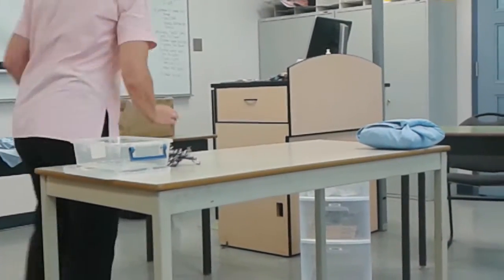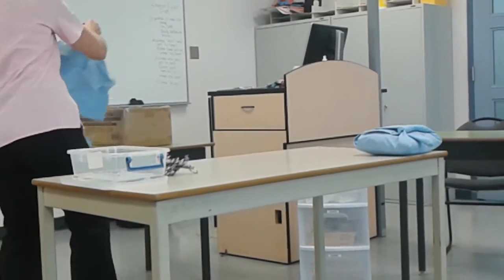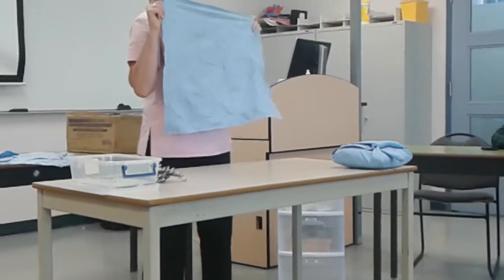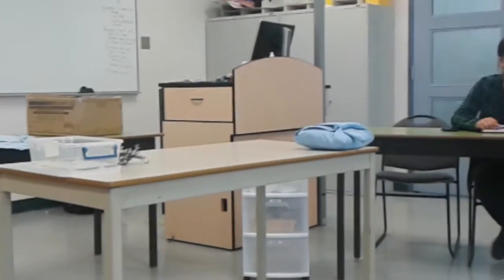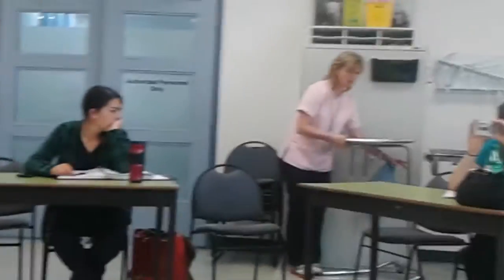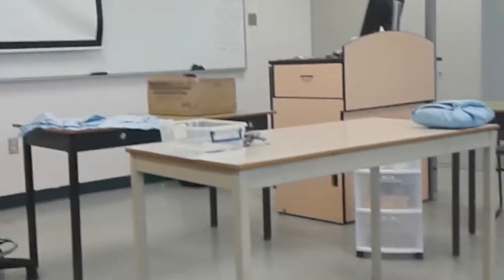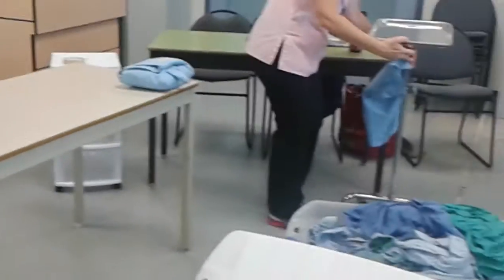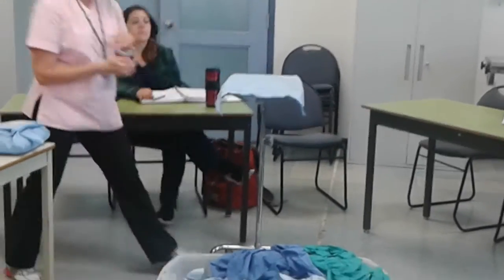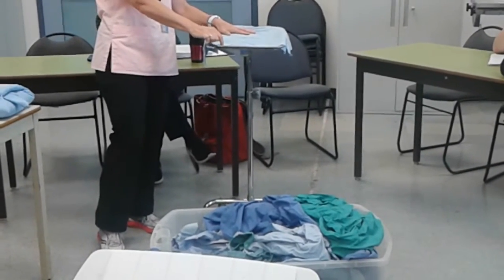When wrapping my instruments, this is a pretty good size pack. The other thing to keep in mind is the Mayo stand — this is what a Mayo stand looks like. I need to make sure that when I unwrap this, it covers the whole Mayo stand. I don't want my instruments touching the stand itself.